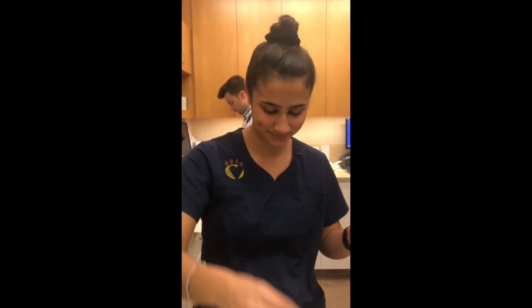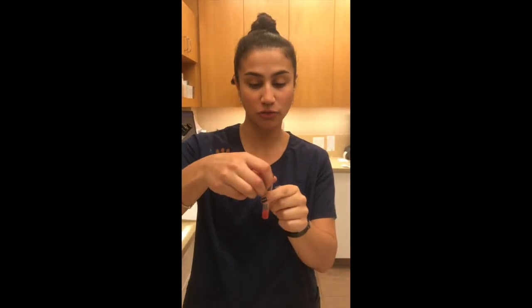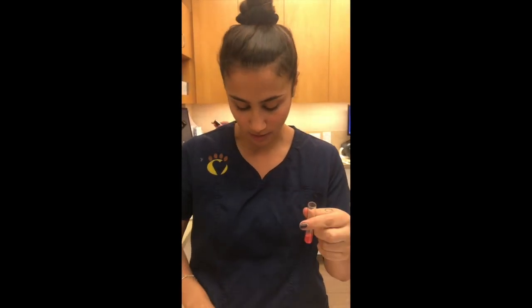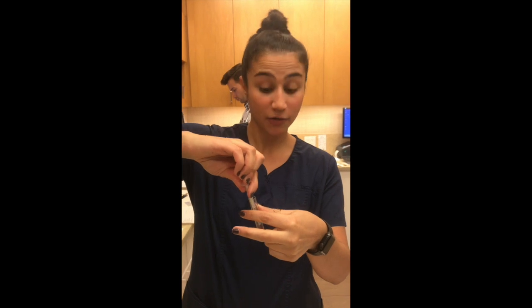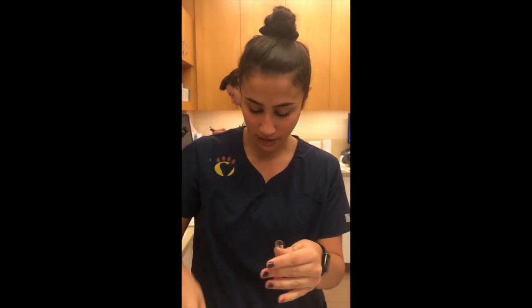Great, so this is our major cross match now. Okay, so now I'm going to be making our minor cross match. First I'm going to take 2 drops of our recipient suspension. We just need blood and then she's done, right? Perfect.